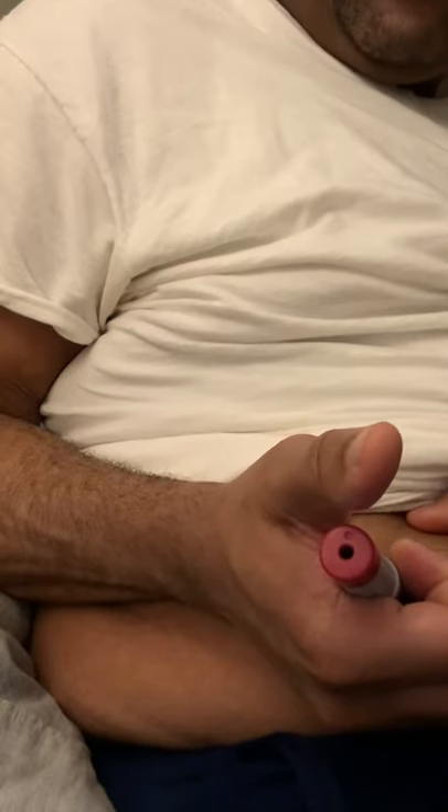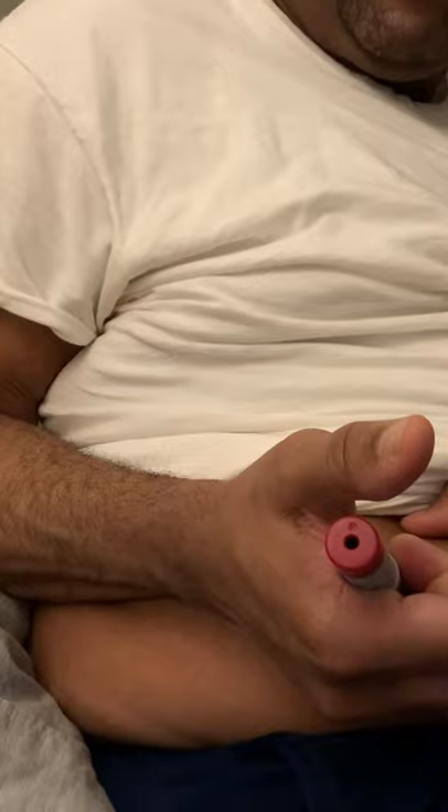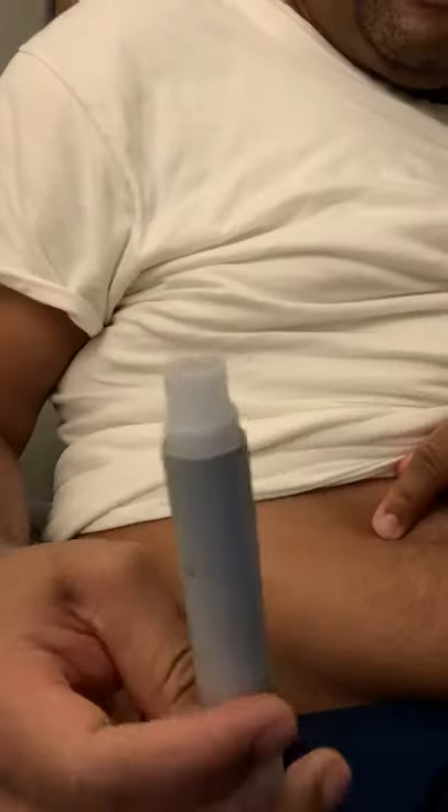I see the yellow indicator light coming down — two, three, four, five, six, seven, eight, nine, ten. As you can see, there's absolutely no fluid on my skin, which means I got all the injection. The yellow indicator light is down, which means I got all the medication. Put this in the trash — you're good to go.